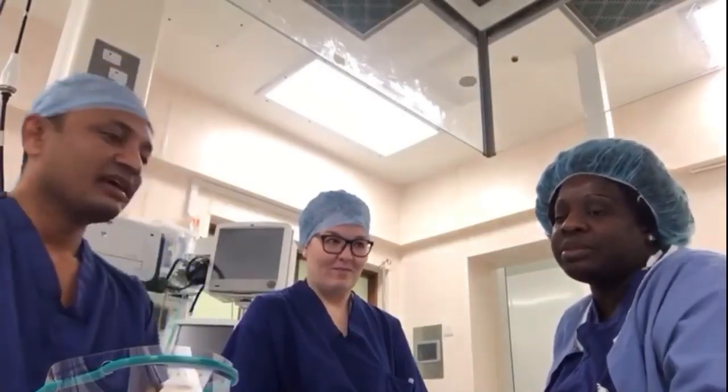Hello, I am Dr. Abhi, one of the doctors. This is Sam, our team leader in this hospital, and this is Nicola, who is a trainer and fit tester for qualified masks. I've got a few masks here and she's going to explain what they are and how they're used.